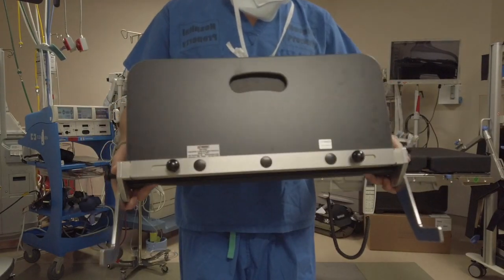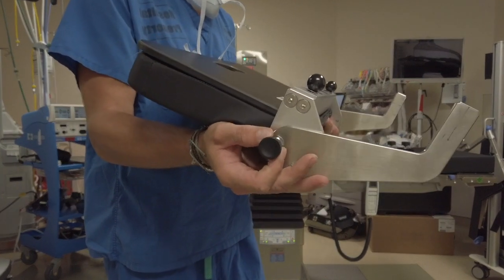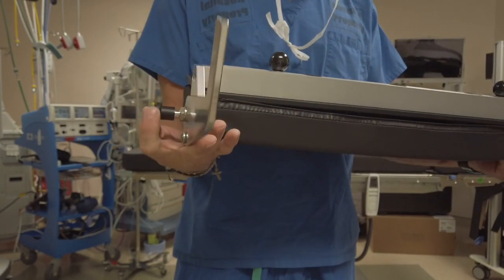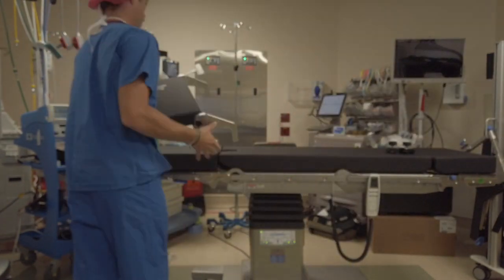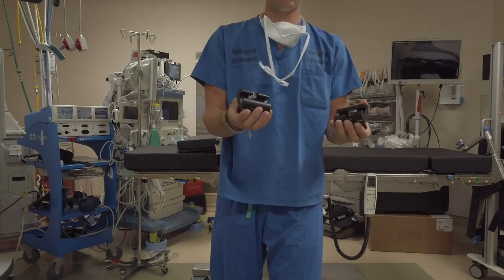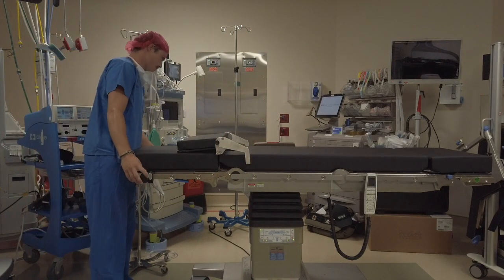If you find yourself in need of a footboard, at the base of the rack you should find the rotatable footboard. The rotatable footboard is dual purpose. It can be used as a tabletop extension and also as a footboard. To attach, first unscrew one of the black knobs on the bottom side to adjust the width to the table's width. Next, place rail clamps on the table and set the footboards into them and lock. When laid flat, this serves as a table extension.